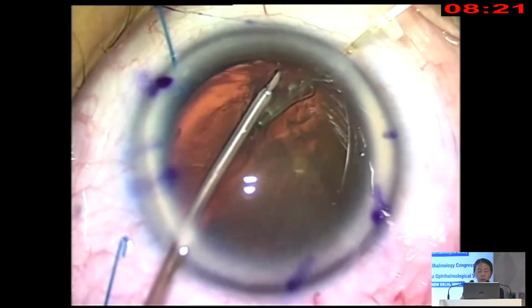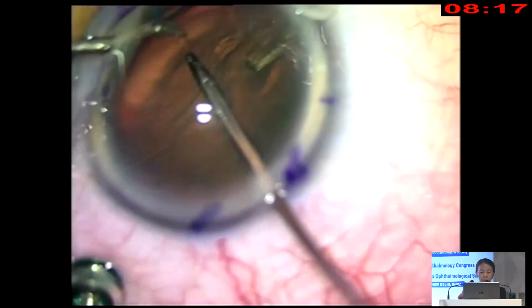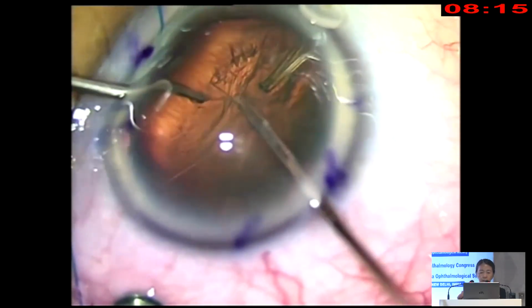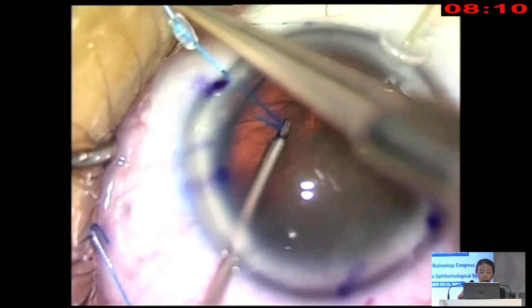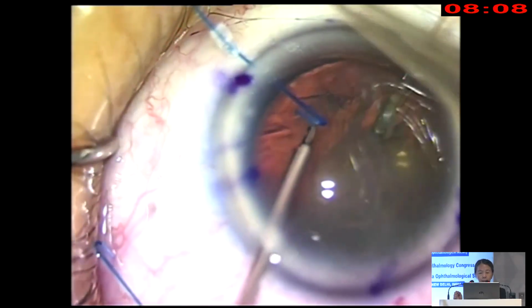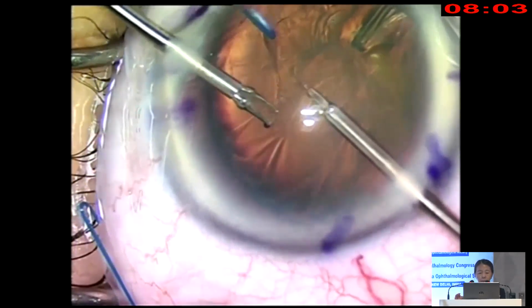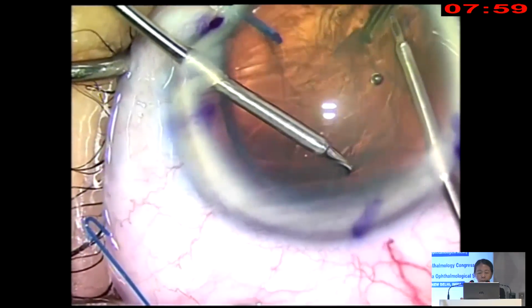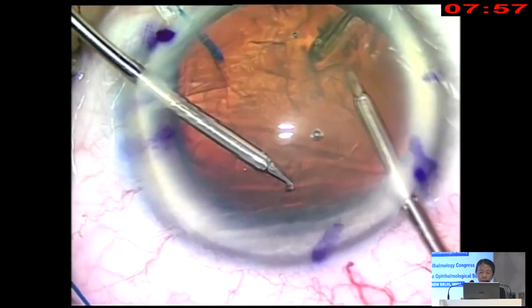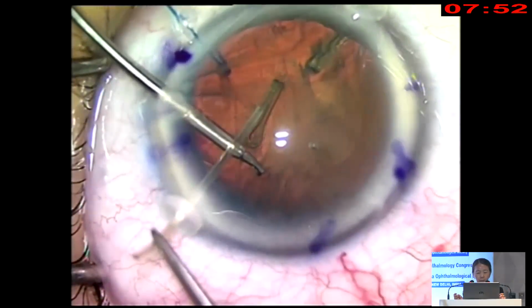Now this is a bimanual technique, all right? So from this stage, use non-tooth forceps, not the capsulorhexis forceps, the non-tooth forceps if you're holding on to the capsule. So I do a bimanual technique, all right? And then you can apply whatever hooks you want at this stage just to provide the support. Iris hooks are easy to manipulate, and you can see really there are no zonules. You do a bimanual technique and look at the equator so that you can center your capsular axis.